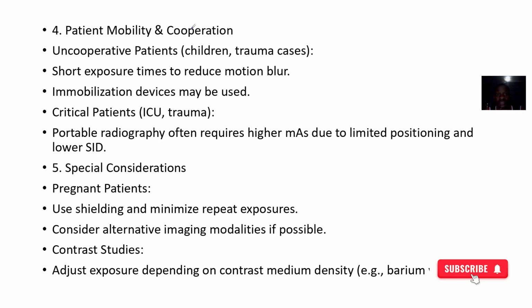So, patient mobility and cooperation. You have to also look at the patient. Are you dealing with a child? Are you dealing with a psychiatric patient? You understand? So you also arrange the imaging as related to the patient. Then also critical patients that are in intensive care units or that have undergone some serious traumas.